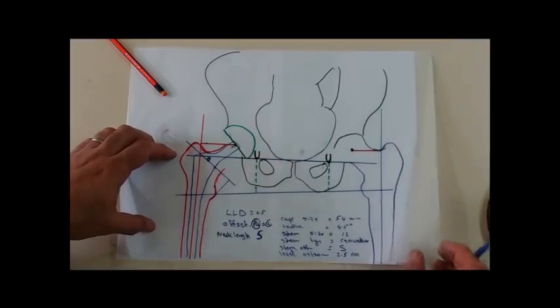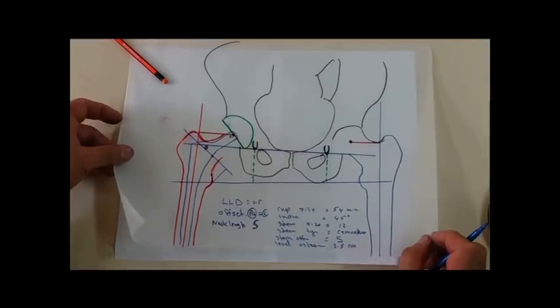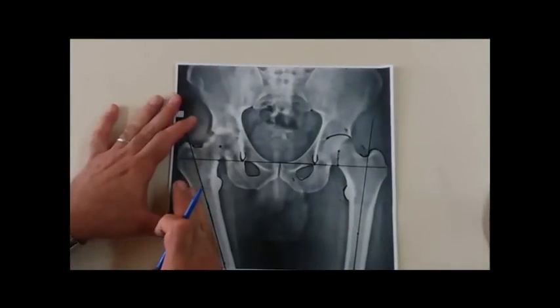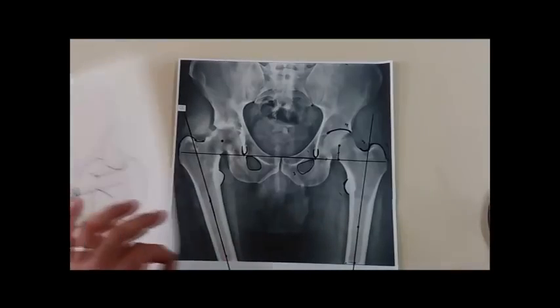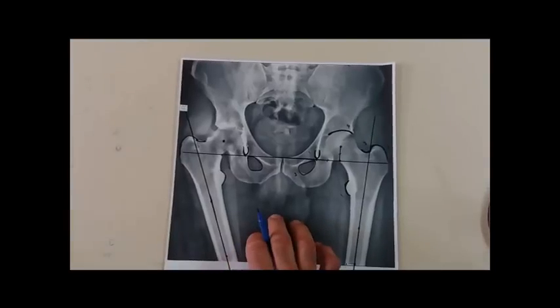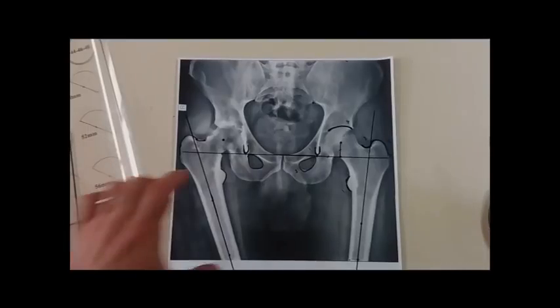A little bit complicated by doing tracing. Also, I will emphasize the same point. I was obliged to do this templating on tracing paper because I already have an adducted hip. If from the start I do not have an adducted hip and can put both in a neutral position, there is no great importance of doing this tracing paper. I can template by using this radiograph as well as the radiolucent template without doing tracing, if I have a neutral femur.